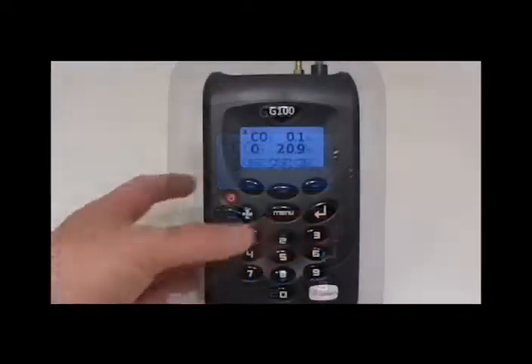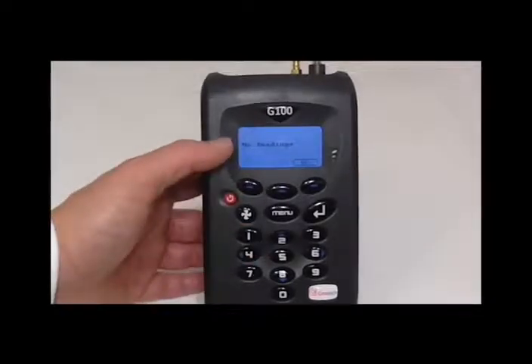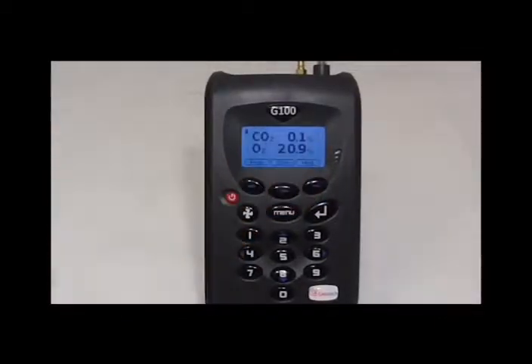If you are happy with that, press exit and press 4 for view data. Just double check there are no readings on the instrument. Double check the memory is clear and you can now exit back to the main reading screen.